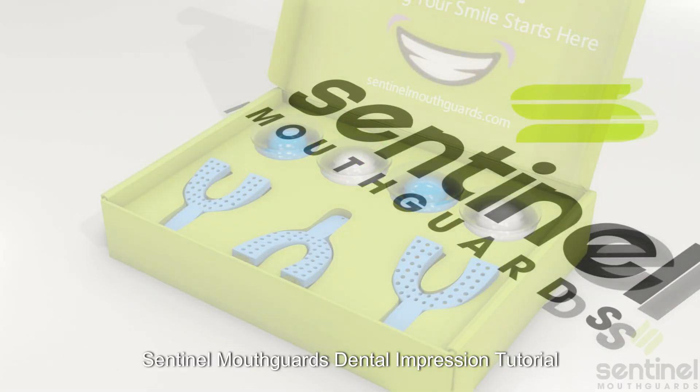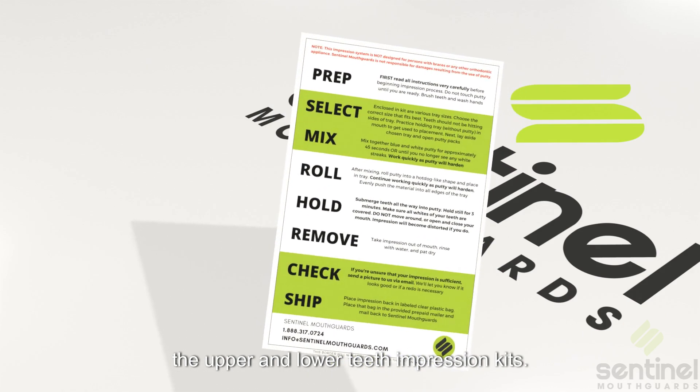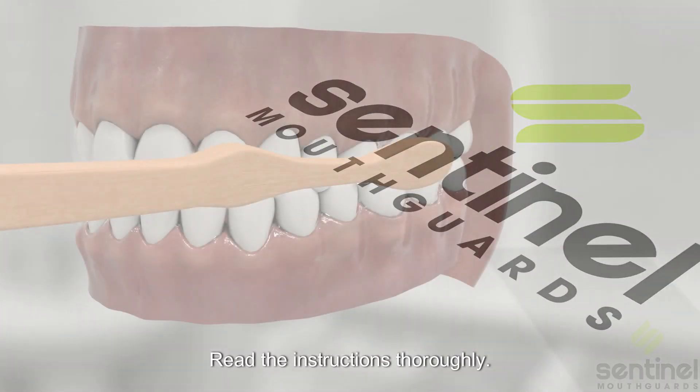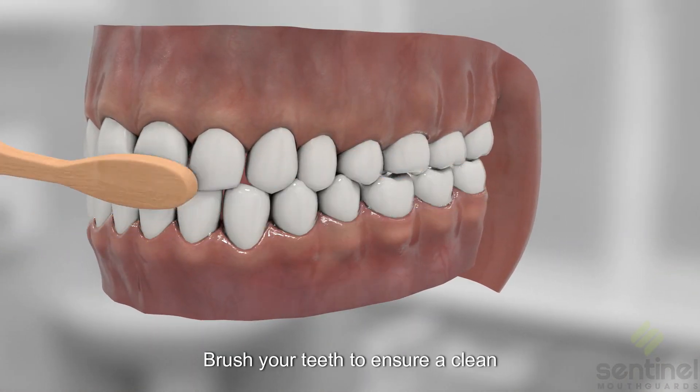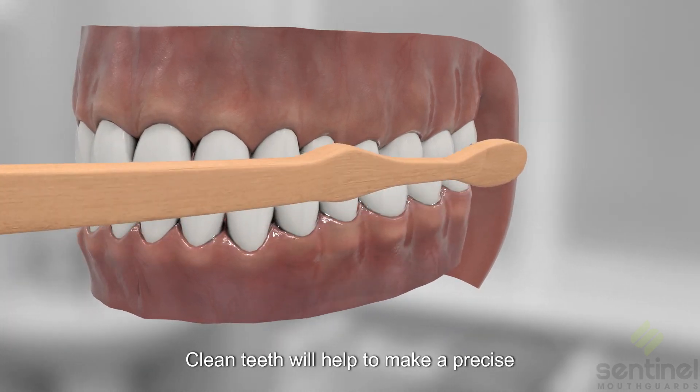Sentinel Mouthguards Dental Impression Tutorial. The following instructions apply for both the upper and lower teeth impression kits. Read the instructions thoroughly. Brush your teeth to ensure a clean impression — clean teeth will help to make a precise impression.